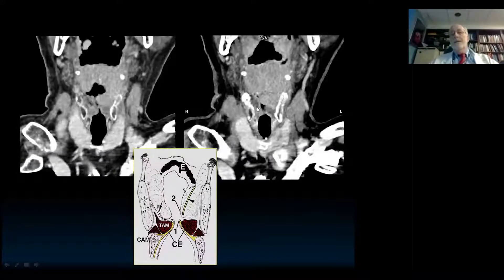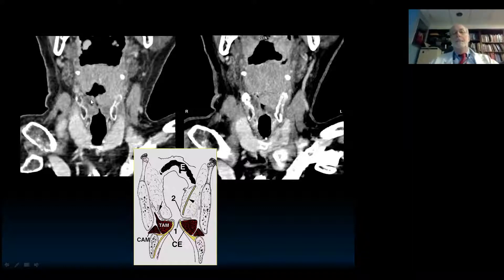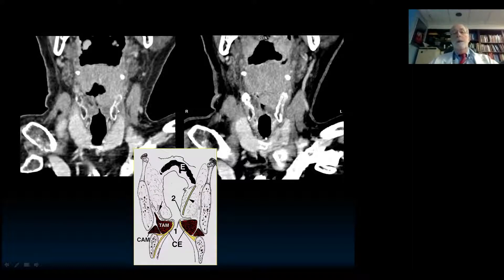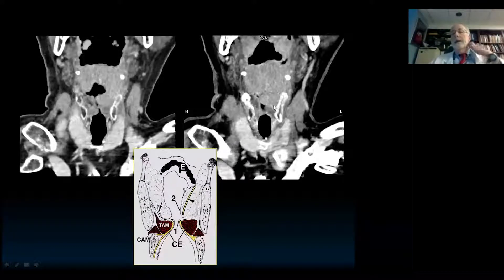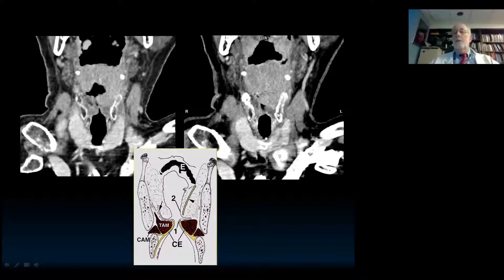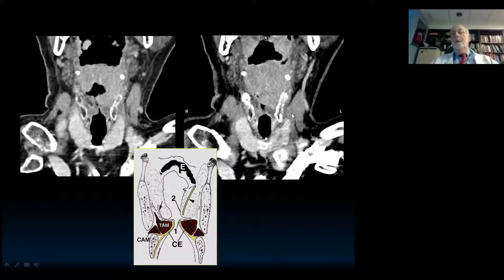This one is right at the edge. Here's the thyroarytenoid muscle, and you'll notice there's a little bit of fat from the paraglottic region burrowing into the outer edge of the muscle — that's what the tumor is going to try to do. It's going to try to burrow into that little crease. If that's the level of the ventricle and you made an incision right through there, you would leave that little knuckle of tumor. They can do a more advanced supraglottic laryngectomy, but they need to know about it first. That's why this is so important.